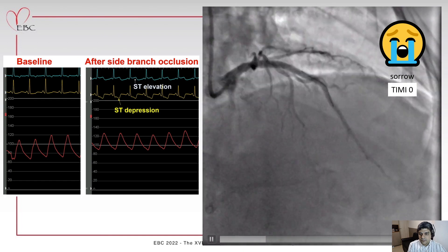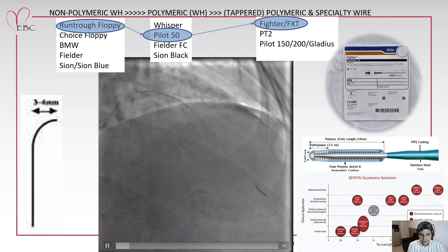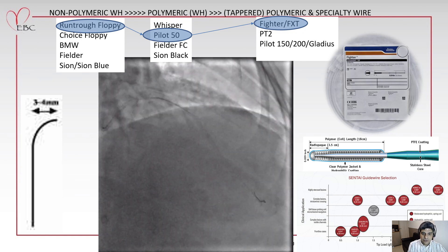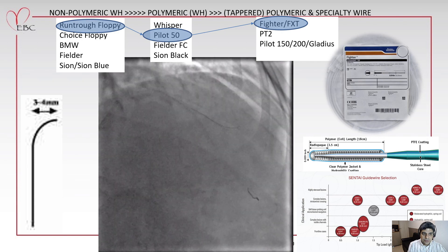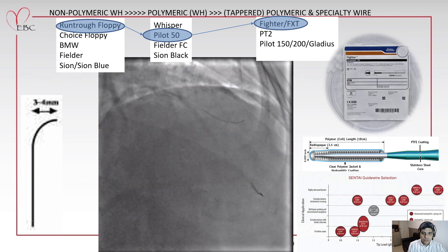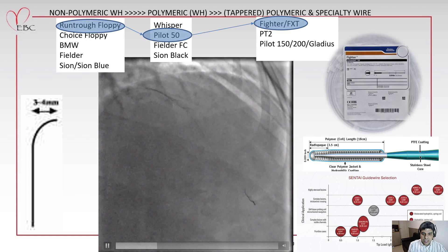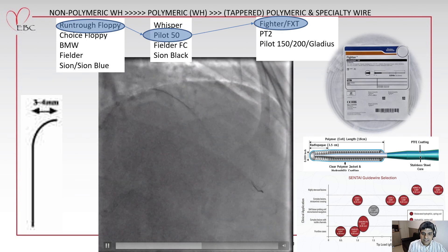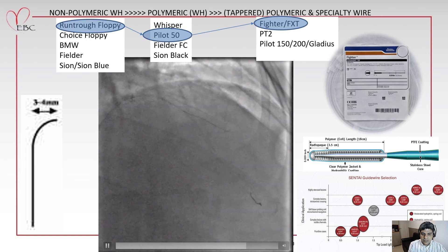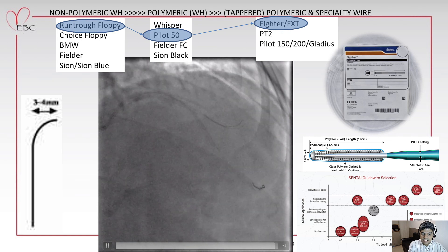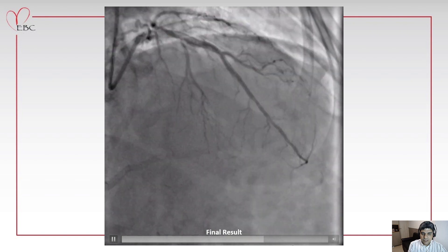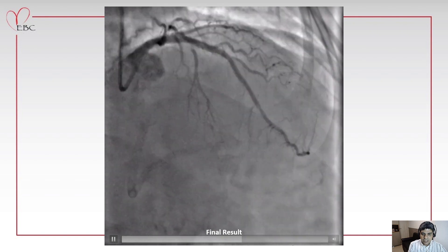The patient had ST elevation, chest pain, and tachycardia. This is our approach for this kind of side branch acute occlusion: we start with non-polymeric workhorse wires, then change to polymeric workhorse, then polymeric tapered wires, and some specialty wires. We start with a regular 3 to 4 mm curve. This case was resolved using the Boston Fighter wire, which was very gently manipulated to seek the channel through the strut, followed by balloon dilation to restore flow. This is the final result with flow restoration on the diagonal branch.